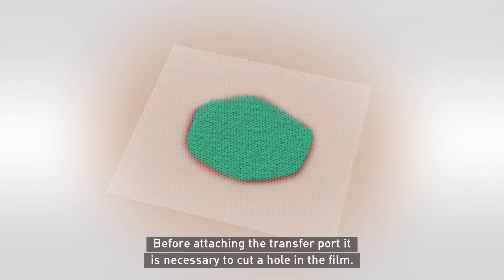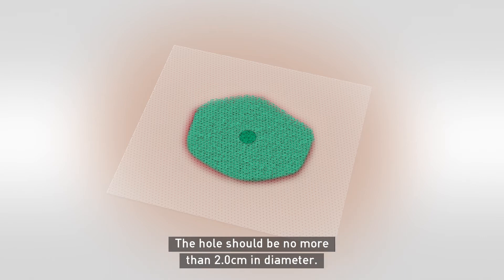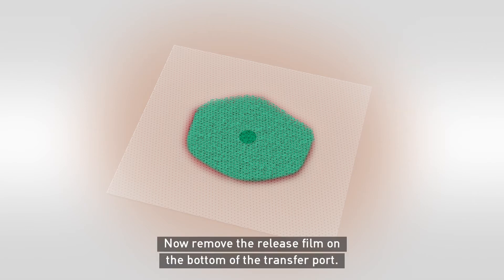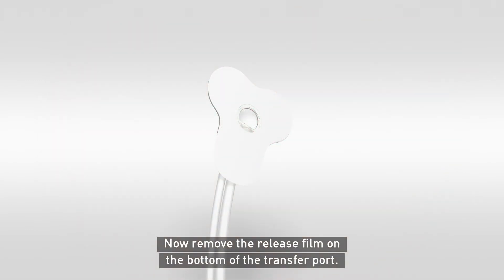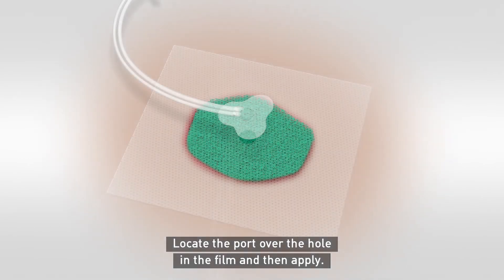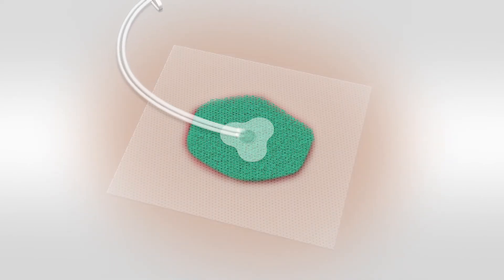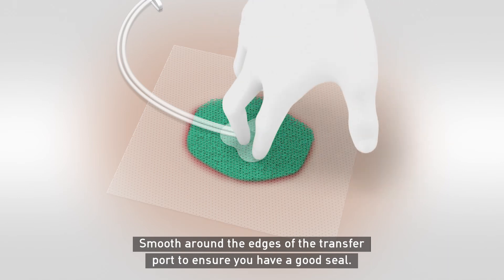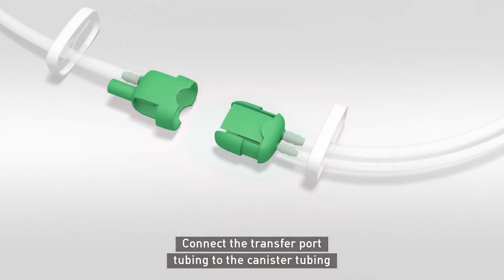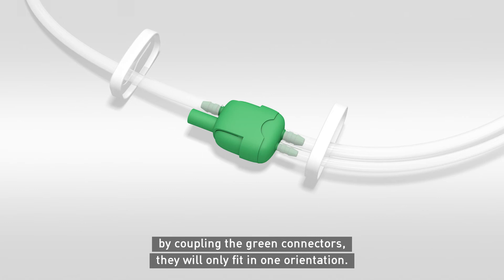Before attaching the transfer port, it is necessary to cut a hole in the film. The hole should be no more than 2.0cm in diameter. Now remove the release film on the bottom of the transfer port. Locate the port over the hole in the film and then apply. Smooth around the edges of the transfer port to ensure you have a good seal.